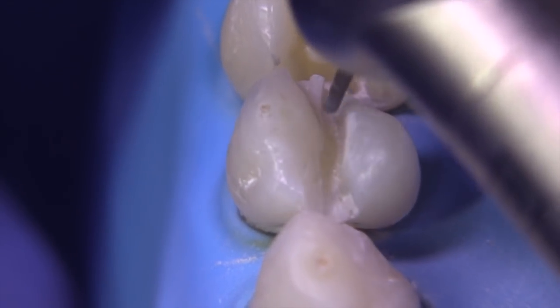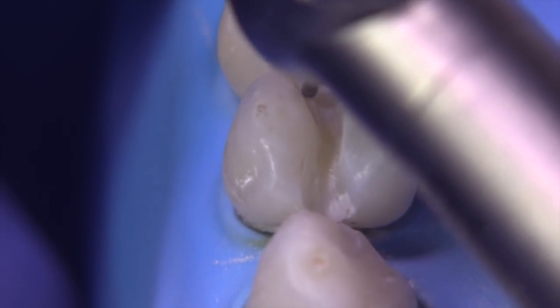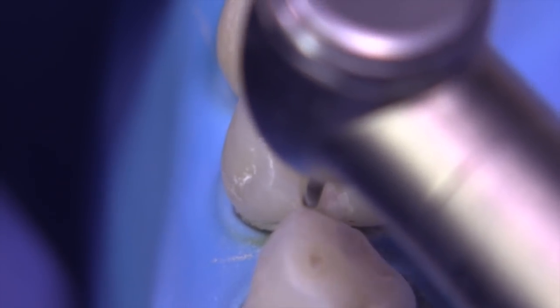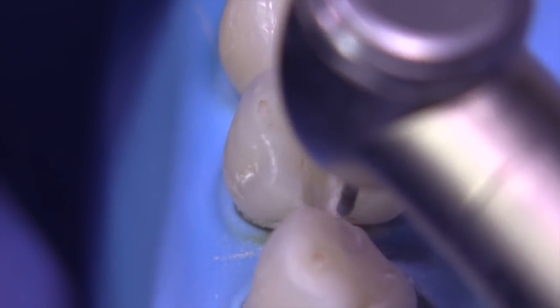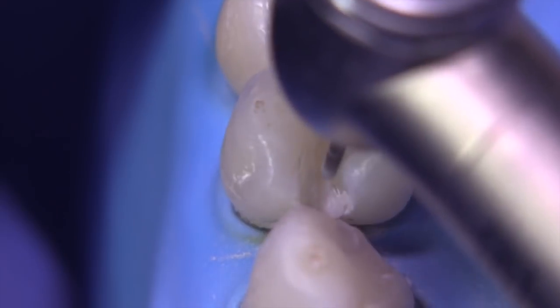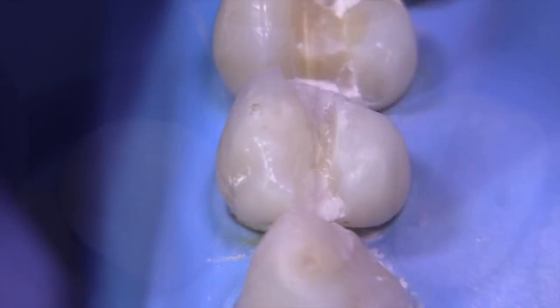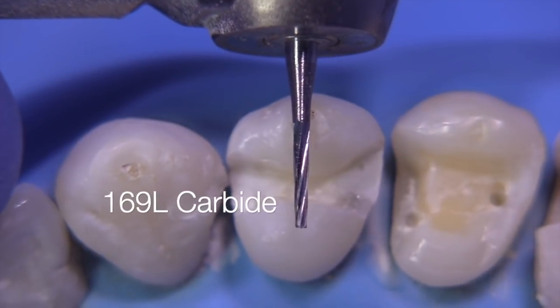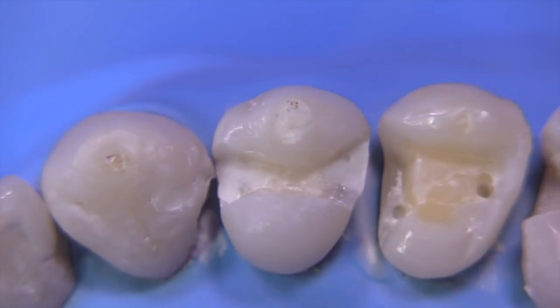In the patient, you're going to be using water spray with this procedure, except for the very end when you're doing the refinement. There's no need for water; just use air spray and a light touch, and you won't heat up the tooth at all. It's interesting to note that studies have shown that the greatest heat generation that occurs in dentistry is with polishing procedures and not with cutting procedures.